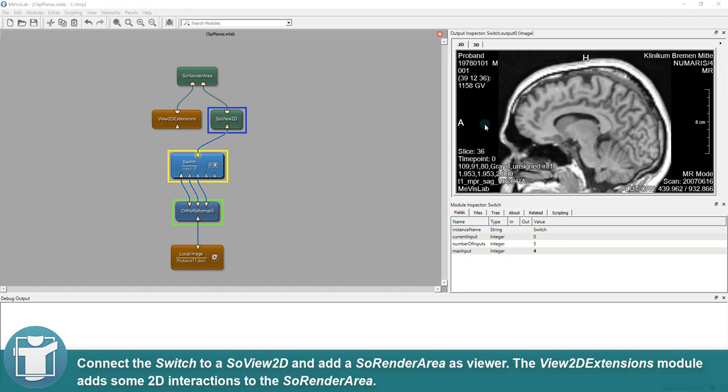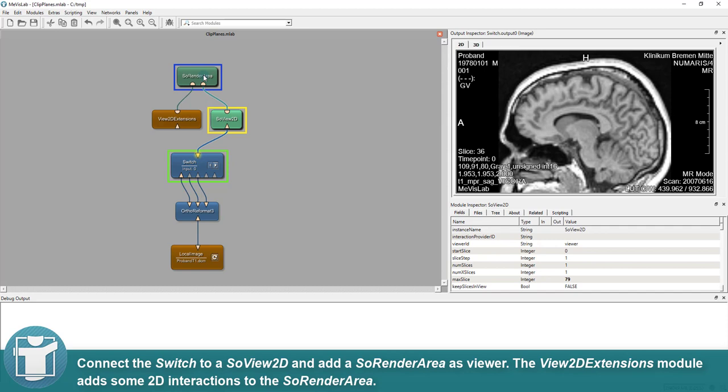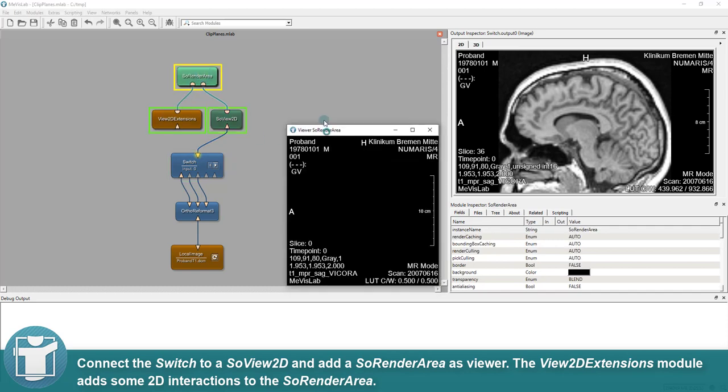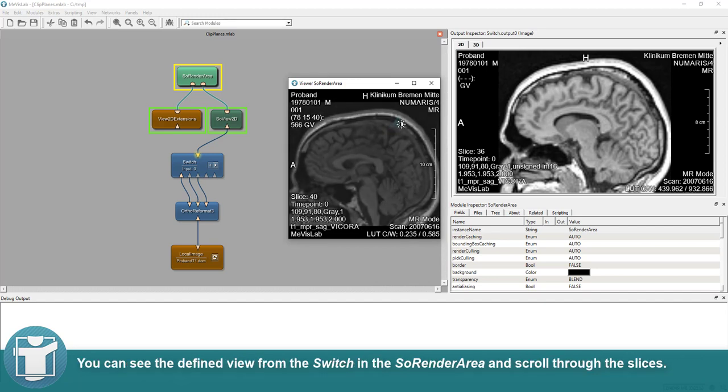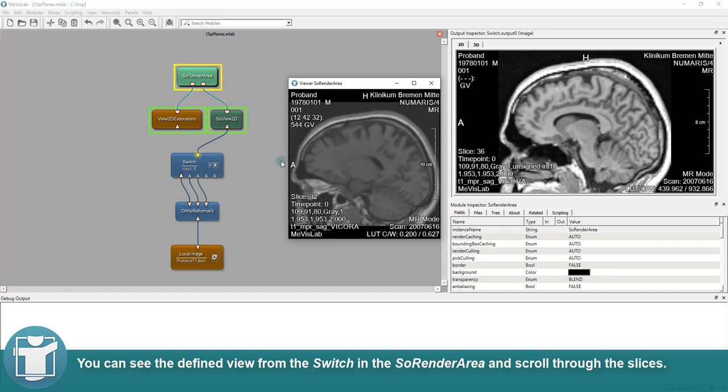Connect the switch to a SO View 2D and add a SO Render Area as viewer. The View 2D Extensions module adds some 2D interactions to the SO Render Area. You can see the defined view from the switch in the SO Render Area and scroll through the slices.